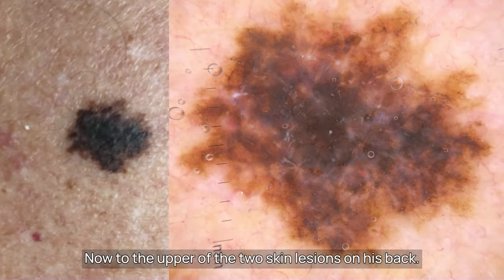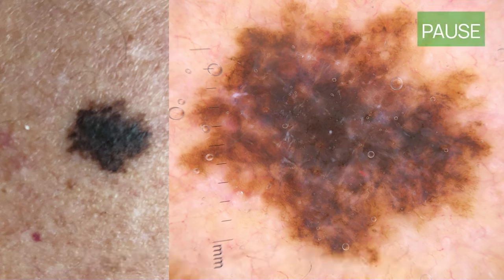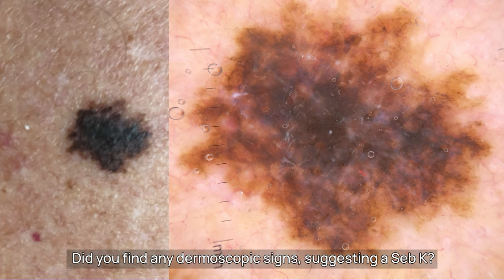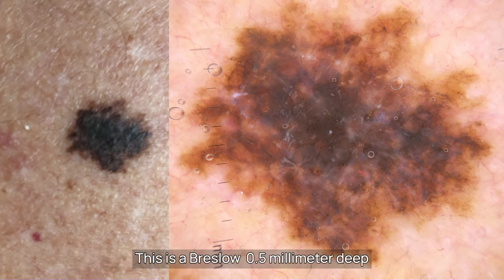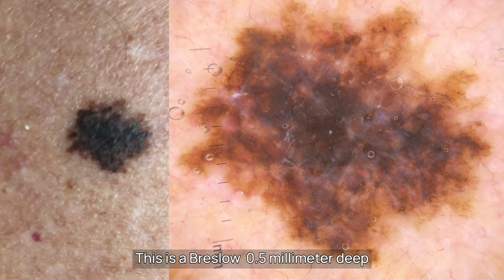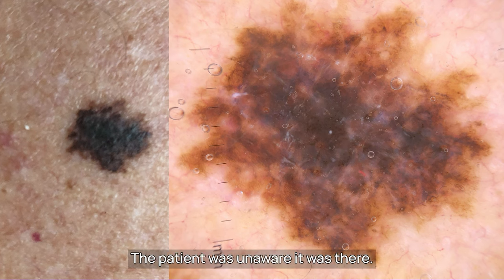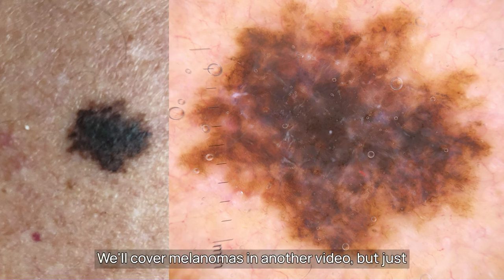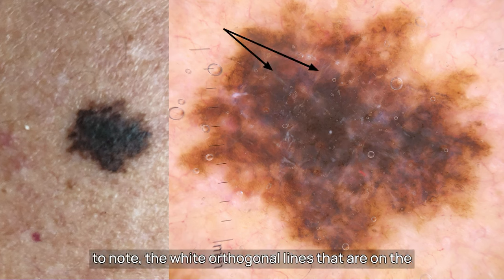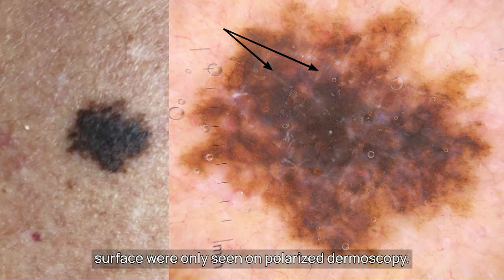Now to the upper of the two skin lesions on his back. Did you find any dermoscopic signs suggesting a Seb K? No — and you'd be correct. This is a Breslow 0.5mm deep melanoma picked up by chance. The patient was unaware it was there. We'll cover melanomas in another video, but just note the white orthogonal lines on the surface, which were only seen on polarised dermoscopy.